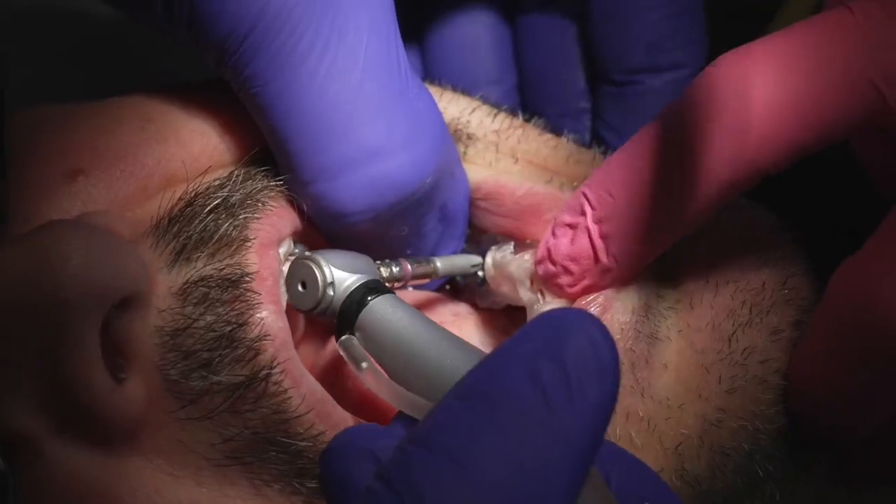As you can see in this workflow, we placed two implants on the lower left quadrant and we did it all in the same visit. What's really amazing about this is I can do everything start to finish — I can preheat the PrimePrint, get the resin ready, and by the time I'm done designing the guide I can send it to the 3D printer. My dental assistant can go and take care of everything: wash it, cure it, remove the supports, polish it up, and bring it back to the operatory ready for delivery.